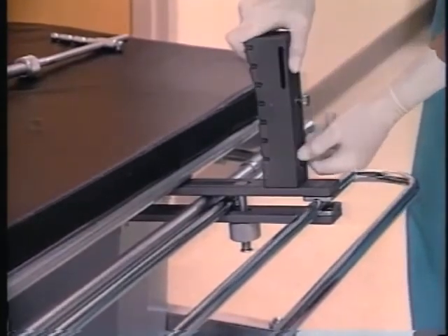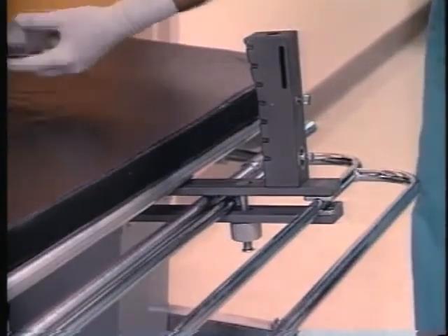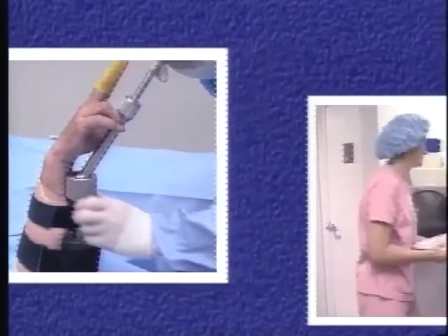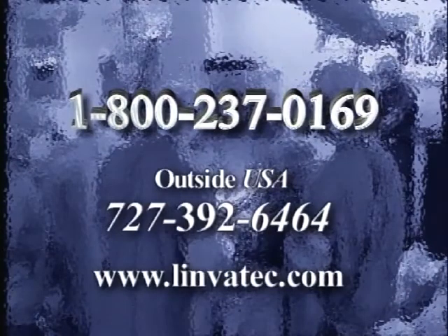With the ER clamp in place and the traction tower attached, the system can be used for a variety of ER procedures including Colles' fracture reduction. The Linvatec Traction Tower Extremity Traction Device provides a safe, sterile, and effective means of positioning a patient for wrist, hand, or forearm procedures. For more information on these and other Linvatec products, please call us toll-free at 1-800-237-0169. Outside the U.S., call 727-392-6464.